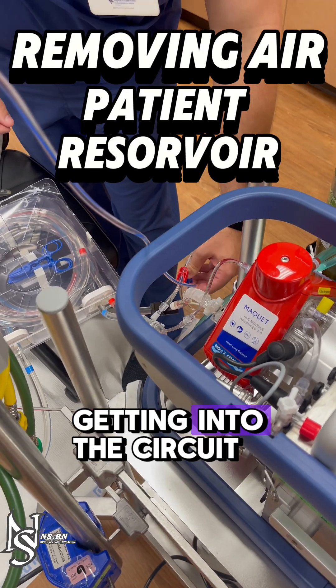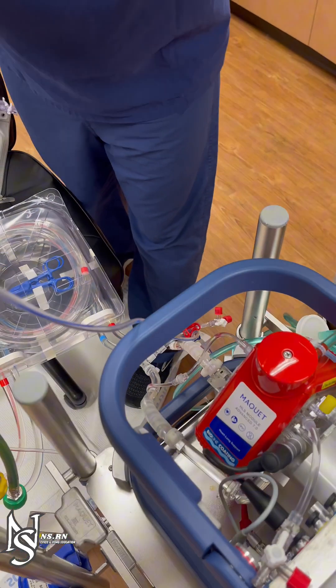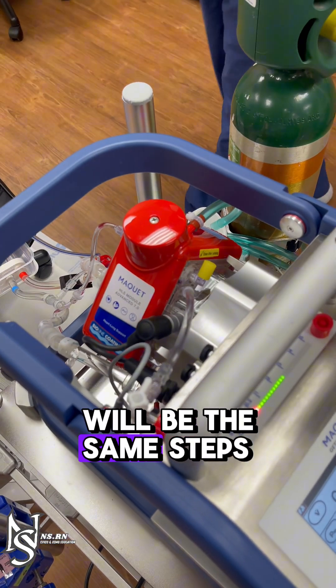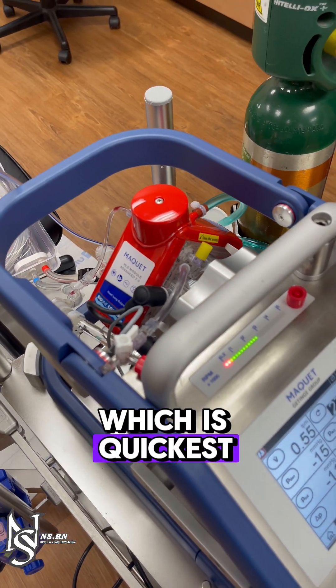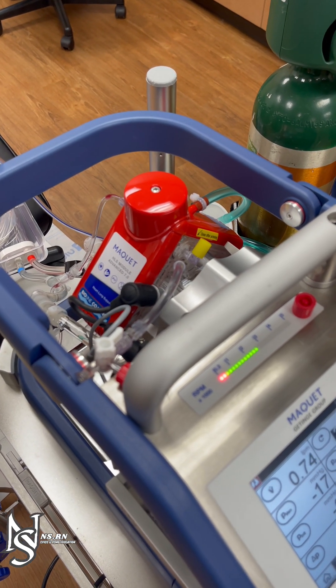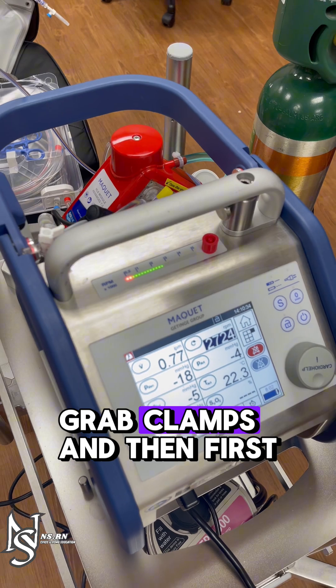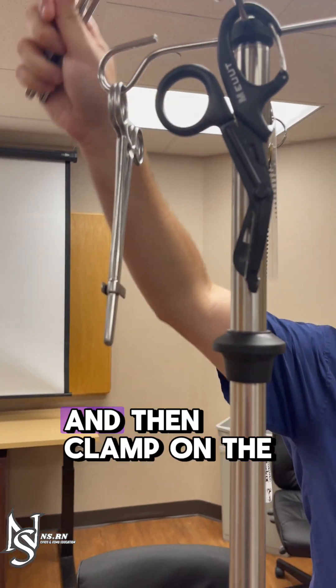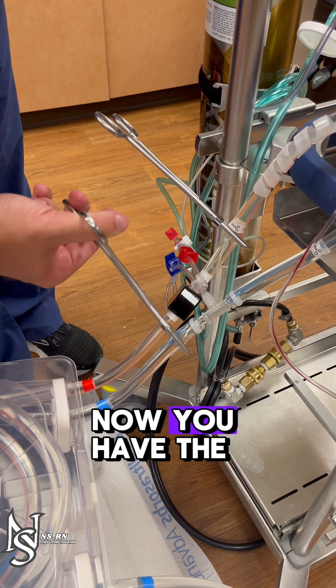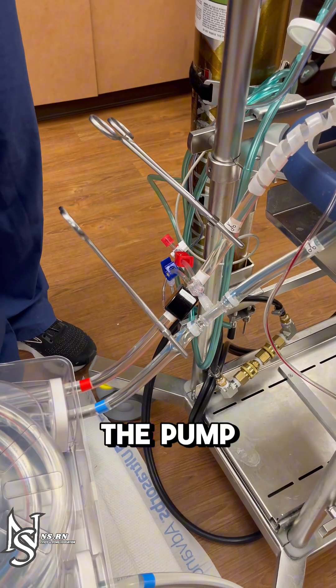In this situation, you have air getting into the circuit without a saline reservoir hanging. Grab clamps and first clamp the return line, then clamp on the patient side of the manifold on the negative side. Now you have the air isolated to one area of the pump.